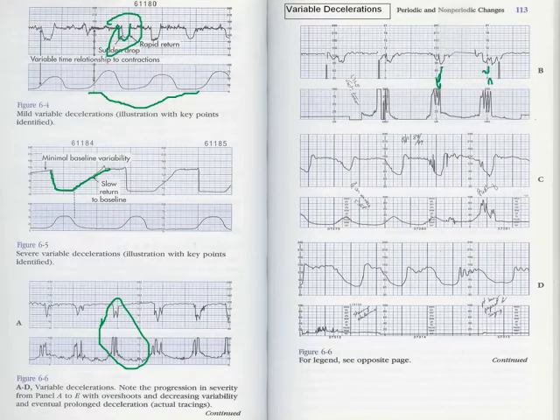Over here, she's pushing as well. She's getting variables. These down here, she's not pushing and she's getting variables. These actually look like shark fins. You've got to really watch her. Now she starts to push. All right, it says pushing right there. So yeah, she was getting ready to push, so that is normal.